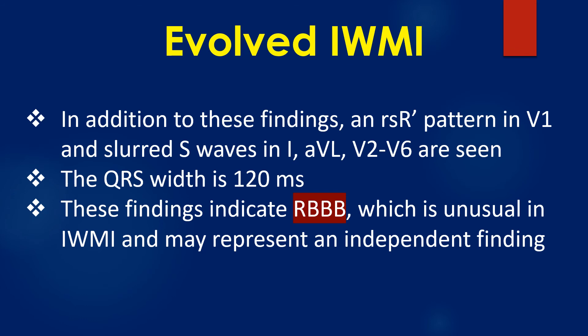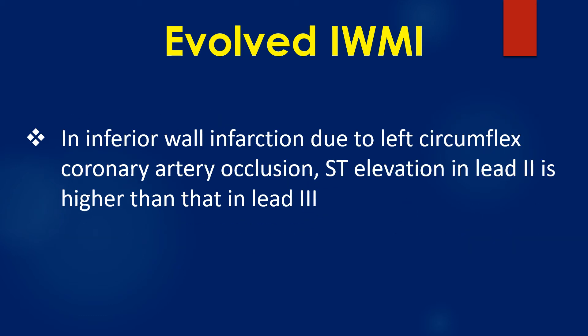In inferior wall infarction due to left circumflex coronary artery occlusion, ST elevation in lead 2 is higher than that in lead 3. In addition, an RSR' pattern in V1 and slurred S wave in leads I, AVL, and V2 to V6 are seen. The QRS width is 120 ms. These findings indicate a right bundle branch block, which is unusual in inferior wall infarction and may represent an independent finding.